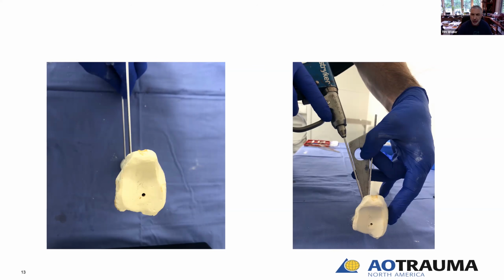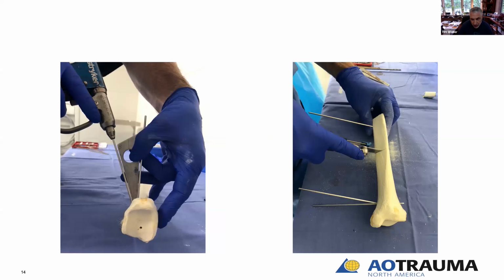One pin in the proximal fragment, one in the distal fragment, and a third pin in the distal fragment. I like to use my triangle there because this way I'm not trying to sight all the way down the leg, but just right there by the other pin, I can accurately judge my correction. And then once my 3 pins are in, I can do my osteotomy.